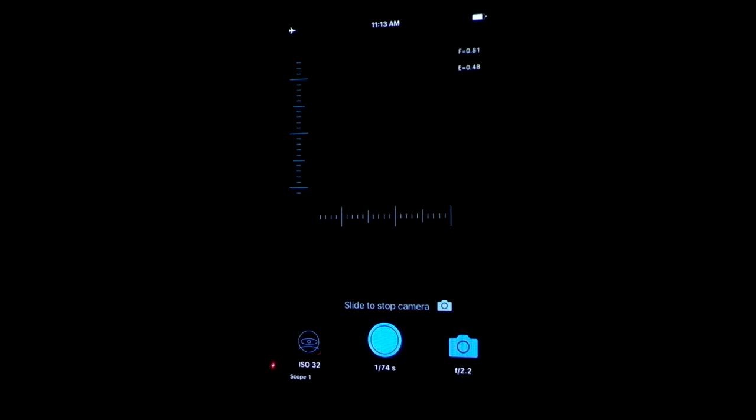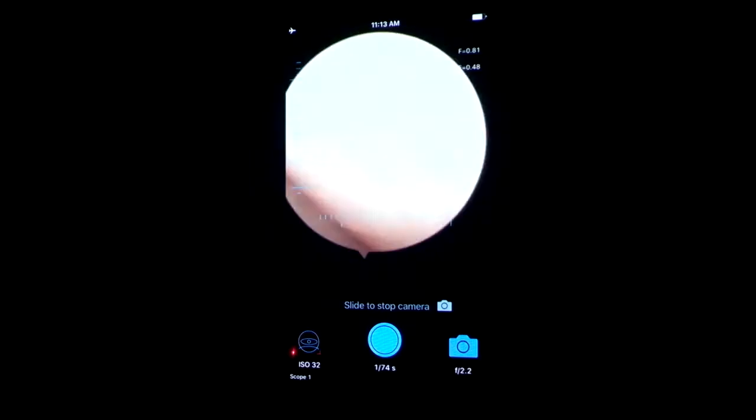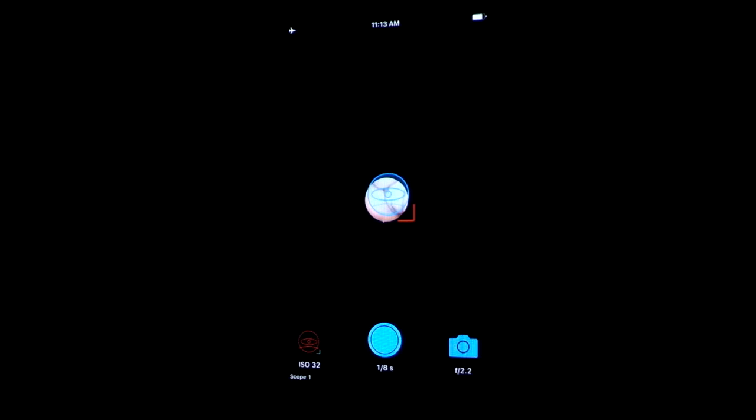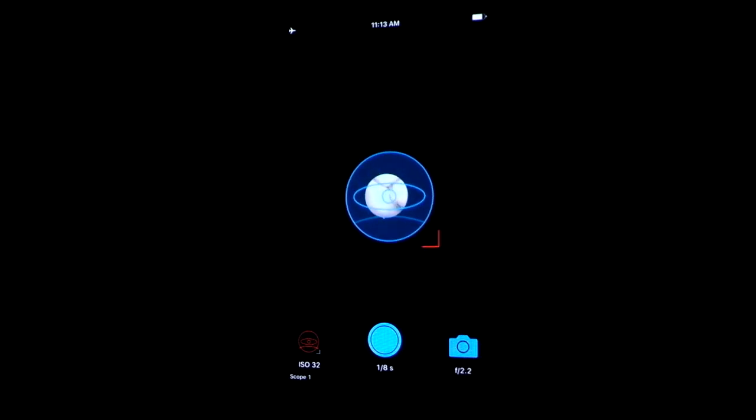The next thing you'll want to do is target alignment of your scope to your camera. Turn your light source on, and then focus in on your hand or a ring finger. Depressing that blue eye in the lower left-hand corner of the screen brings up your target alignment. Now you can move this blue eye around the screen and you want it to overlap with what the scope is looking at. If you pull the red right angle, that can make the image larger or smaller on your screen.